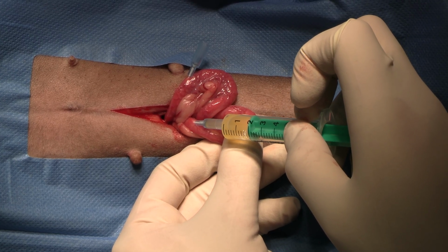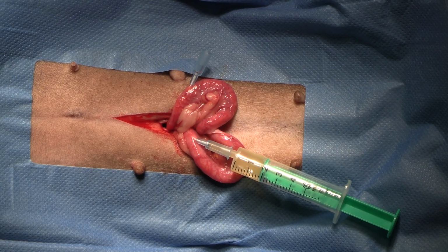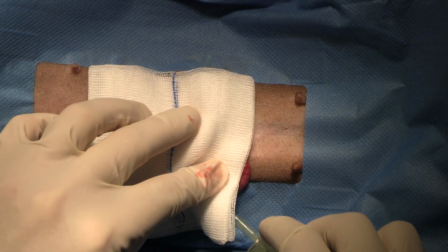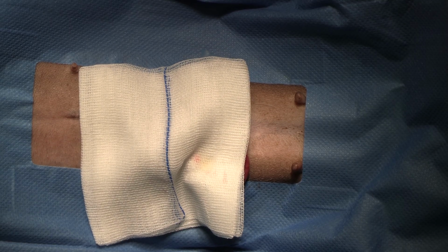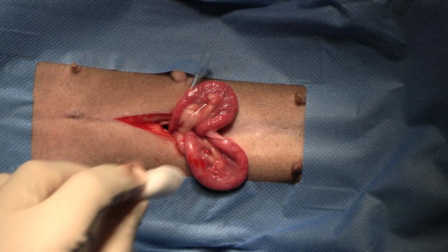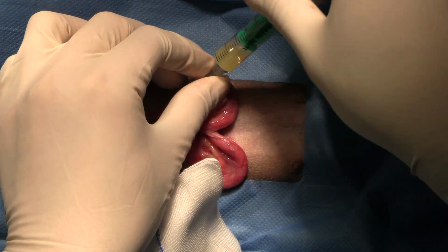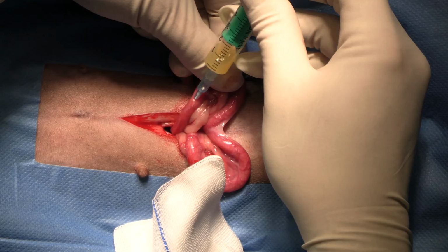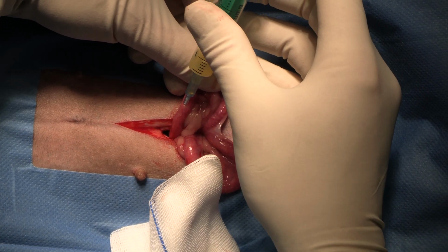We do around half the semen in one horn. Let's pull this catheter out. I do not use any clamps or anything like that. That will just kind of ooze out there, that's fine. Again, firmly connecting it up to my other side. And just injecting again, nice and slow.